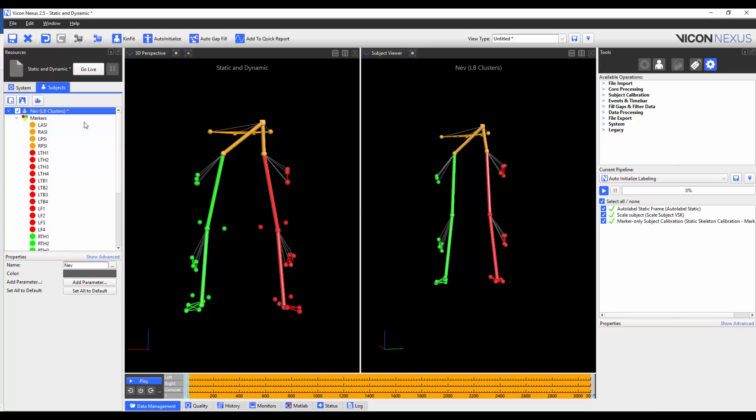Now that I have done a static calibration, I could either use this calibrated subject for auto labeling the dynamic trials, or I could perform a functional calibration to further optimize this subject. The decision as to which step to choose will likely depend on the quality of the original VST, and how dynamic the movements are in the subsequent trials. This can usually be determined by performing a quick pilot test after creating your VST.